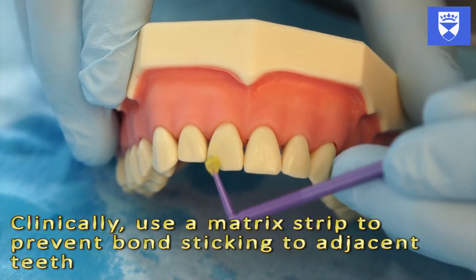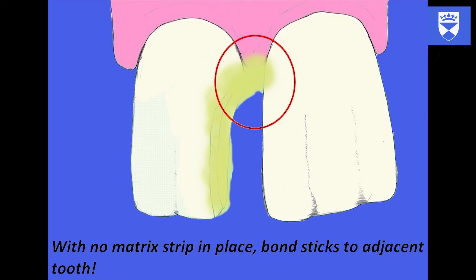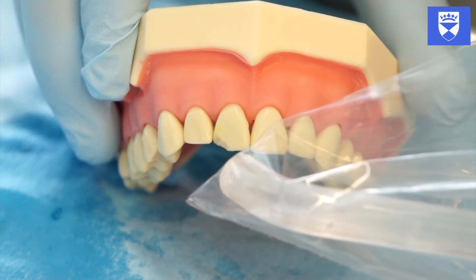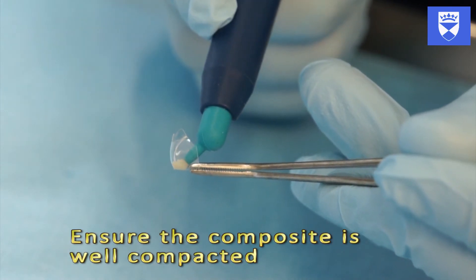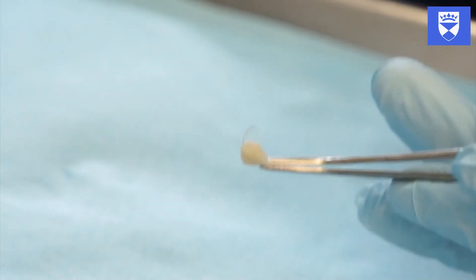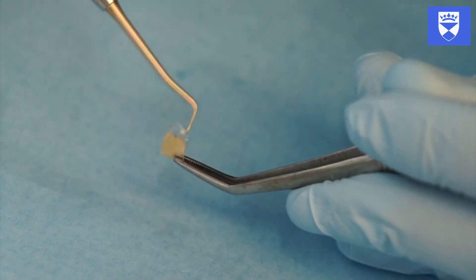Allow the bonding agent to soak for 20-30 seconds, then gently air-thin. Light cure the bond for 30 seconds. Load the prepared crown ensuring that no voids are evident. Further compact the composite using an instrument if necessary.